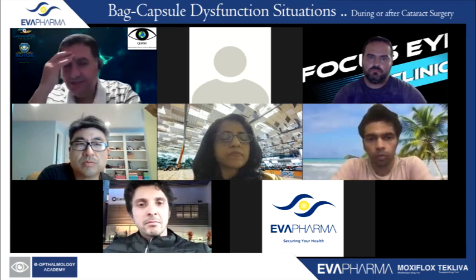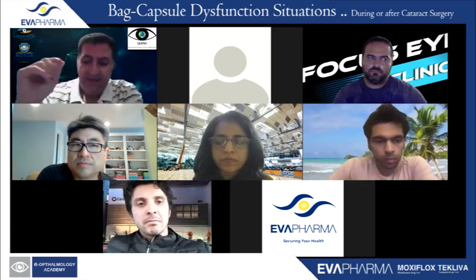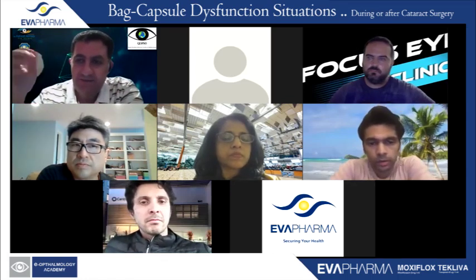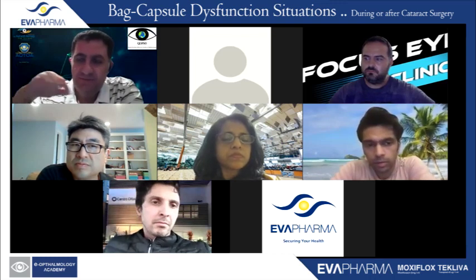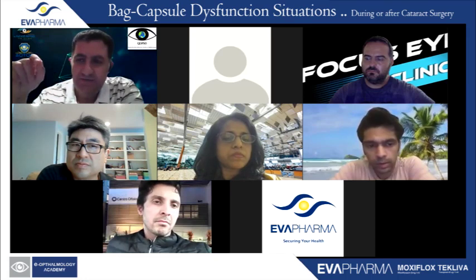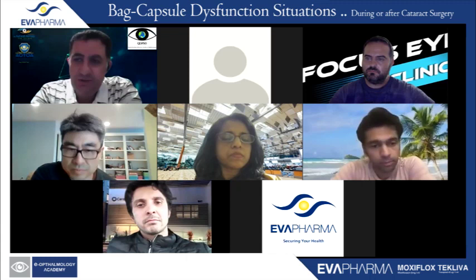Small question. Did you see in your Yamani technique any intrusion of the knot after some time? Some people now do a conjunctiva flap. They put the knot to the sclera, then they close the conjunctiva, not to have protrusion of the knot through the conjunctiva.